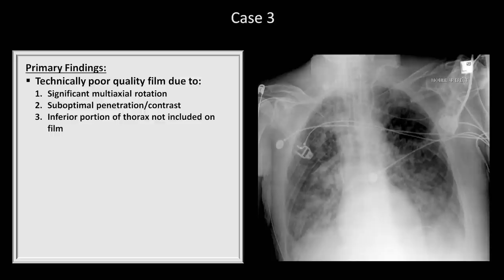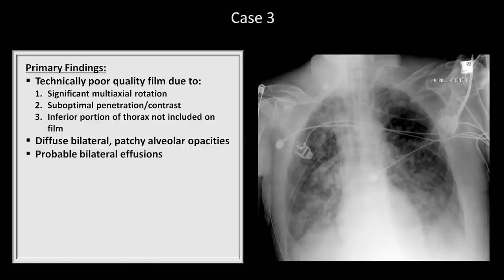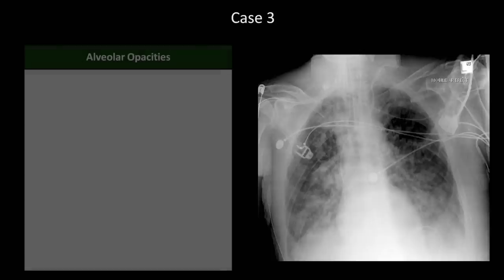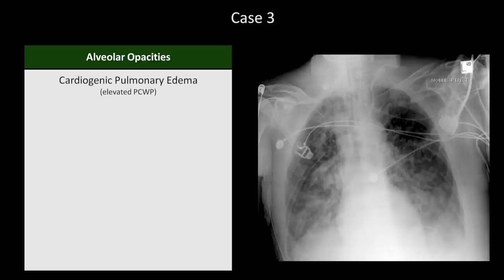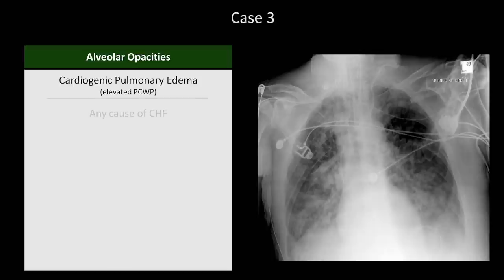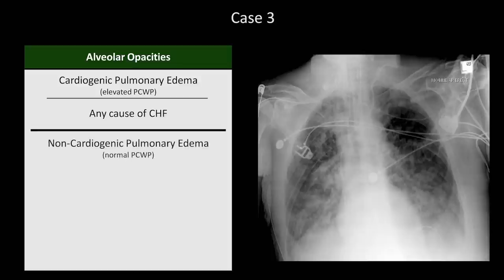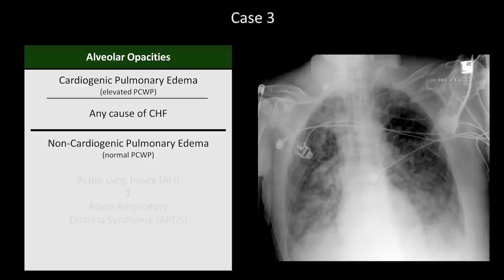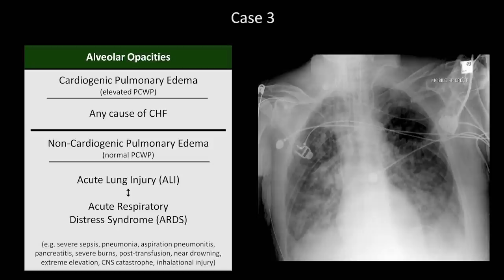Moving on to the actual findings, there are obvious diffuse bilateral patchy alveolar opacities with probable bilateral effusions. The etiologies of diffuse alveolar opacities can be divided into two categories. First, there is cardiogenic pulmonary edema, which is associated with an elevated pulmonary capillary wedge pressure, a surrogate for left atrial pressure — any cause of CHF can lead to cardiogenic edema. The other category is non-cardiogenic pulmonary edema, which has a normal wedge pressure. Diffuse non-cardiogenic edema is often placed into the spectrum between the clinical entities of acute lung injury and acute respiratory distress syndrome, or ARDS. There are many etiologies of non-cardiogenic edema, most notably severe sepsis, pneumonia, and aspiration pneumonitis.